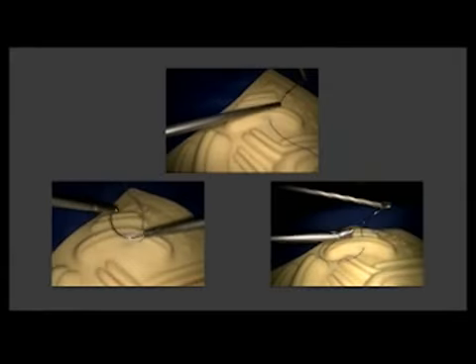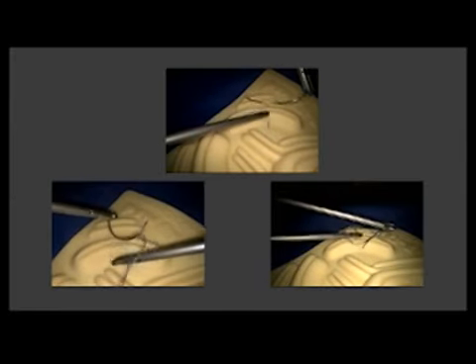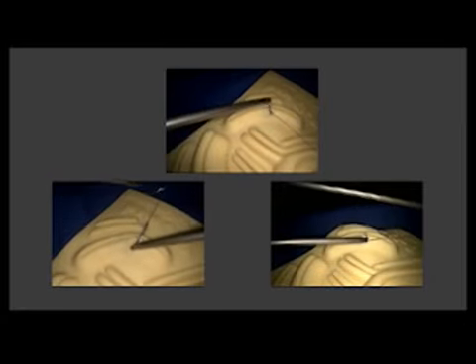Proficient laparoscopic suturing requires an understanding of how the plane of the port configuration corresponds with the visual angle of triangulation and how to systematically manipulate the suture and tissue to perform the desired task.